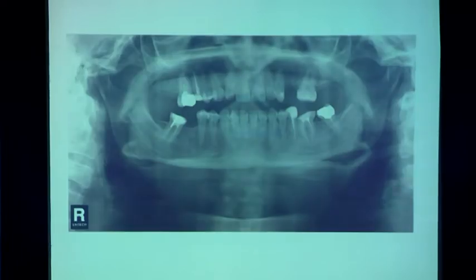Okay, this is the bonus slide. This is the last slide and the bonus slide. I told you in the beginning, when the patient is positioned far ahead in the chin up, you sometimes tend to visualize even the thyroid cartilages, right? When you see the thyroid cartilages, this patient came to us. Again, this is an incidental finding.